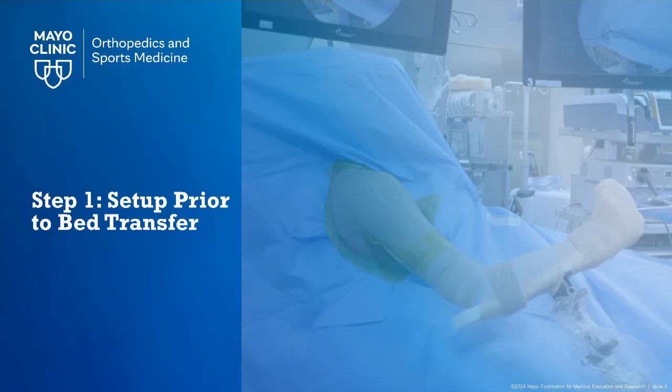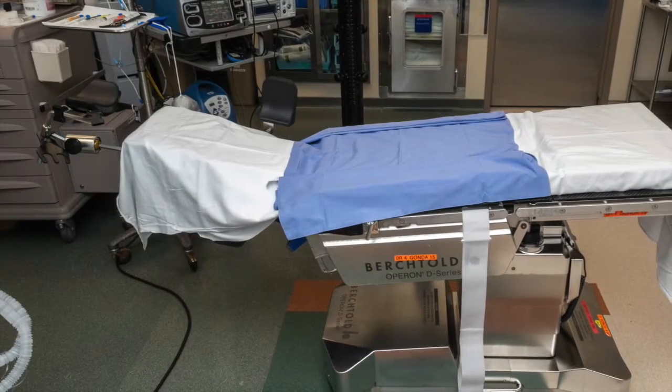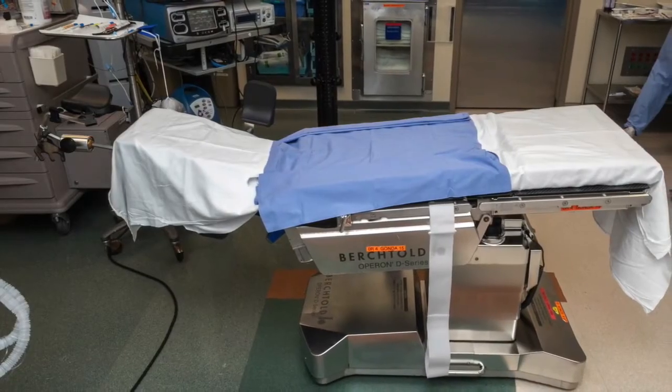Prior to patient transfer to the bed, it is essential to make sure all equipment are available for efficient positioning. Before the patient is brought into the room, a gentle bend is placed in the bed. This allows for the patient to localize their hips to the right location during transfer to eventually facilitate sitting upright.